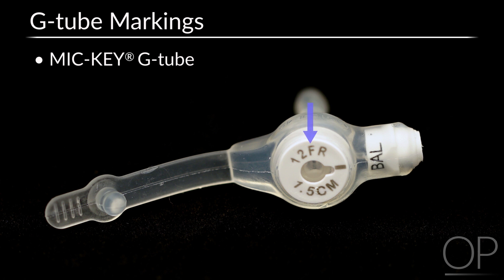This is a 12 French G-tube, and it is 1.5 centimeters in length. The letters B-A-L indicate the balloon port. However, the balloon volume does not appear on the external base.